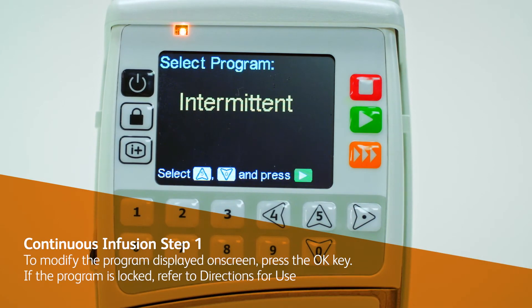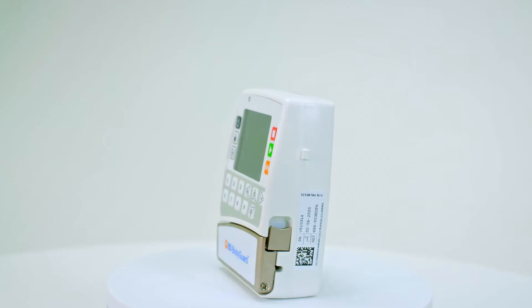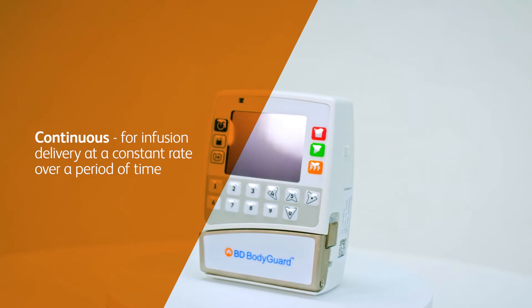If the program is locked, you can only run the program with its current settings. The following program steps apply to a continuous treatment.